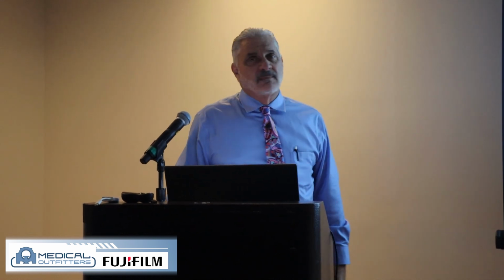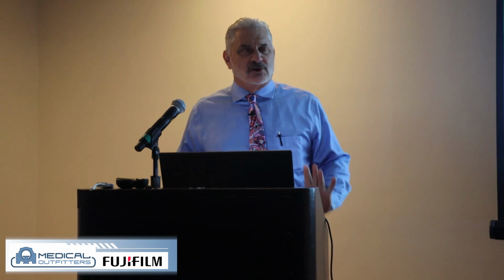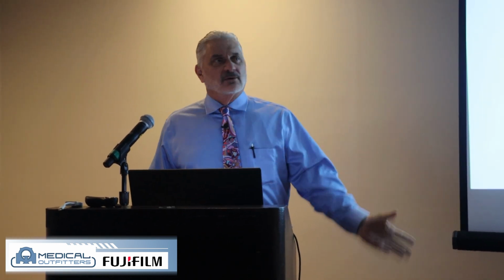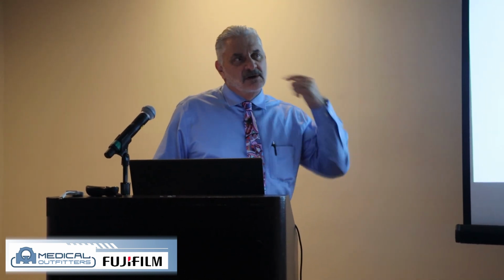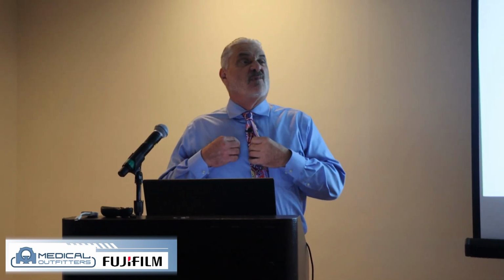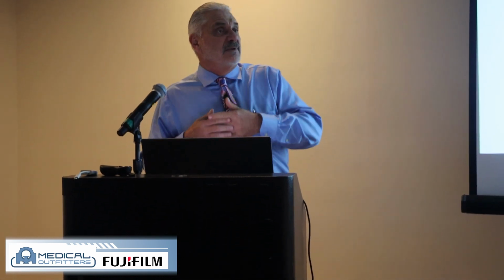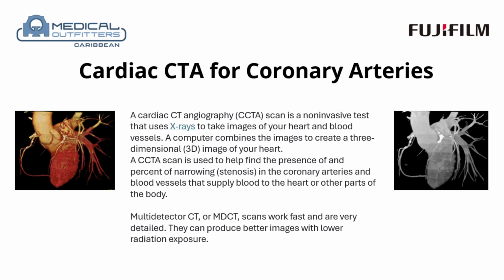you've already got them on the table and you can inject them with 100 cc's of contrast and move forward through the next exam. But the score should not strictly dictate how you treat the patient. I work with several radiologists in South Florida that treat the patient, not the score. So if the patient shows more signs and there might not be a huge score, but those atherosclerotic markers are in the left main or in the LAD or at a bifurcation, they might want to move forward from there as well. So that moves us right on to cardiac CTA of the coronaries, right?